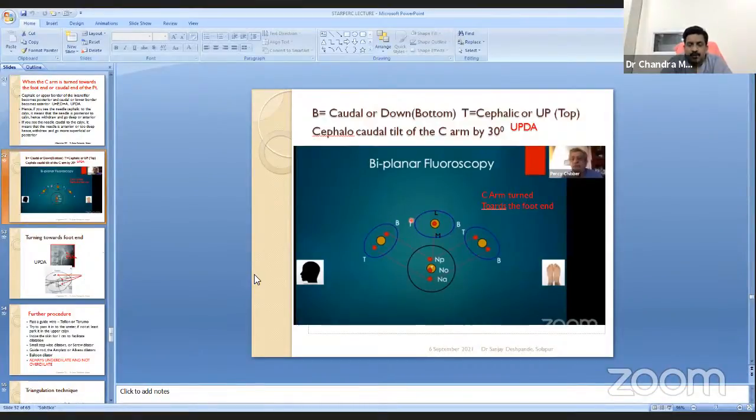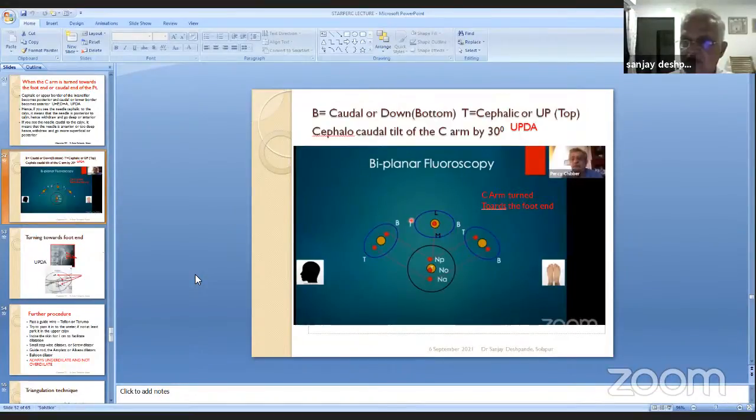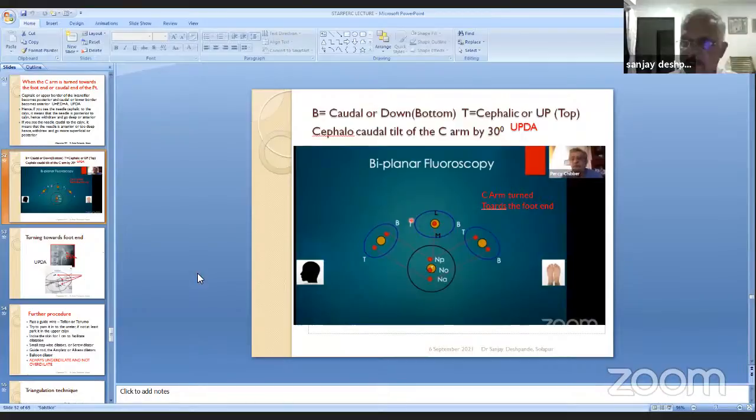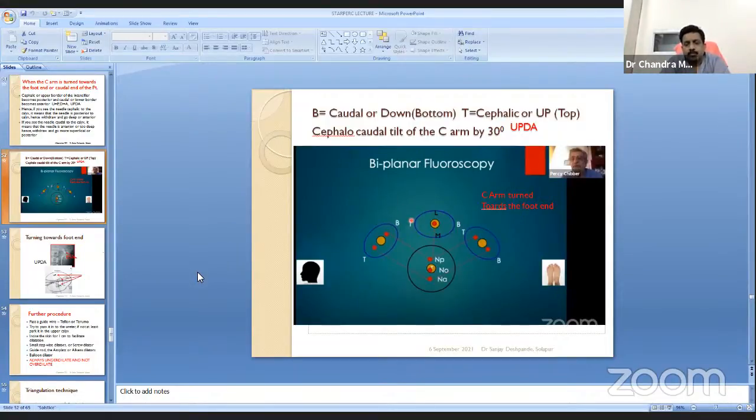Sir, you have seen Jaydeep Datte and Chibbar sir, they are also extraordinary PCNL surgeons. What do they say, in which position? For example, all you juniors who are listening must remember that the radiation comes from below the table and goes towards the screen. That is the first thing. Everybody knows this, but we should not forget it when we are doing the puncture. So in which position will the radiation go away from you? I feel if it is tilted 30 degrees away from the system, the radiation will go away. I think I am correct, sir. Correct.